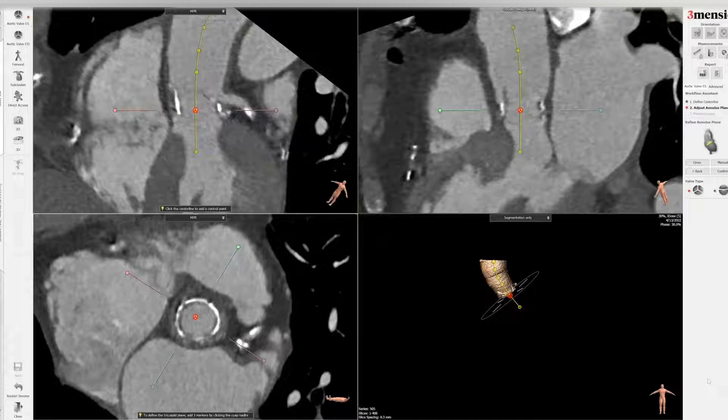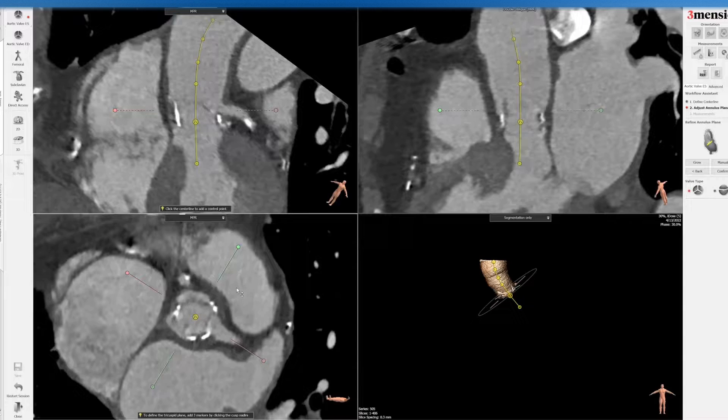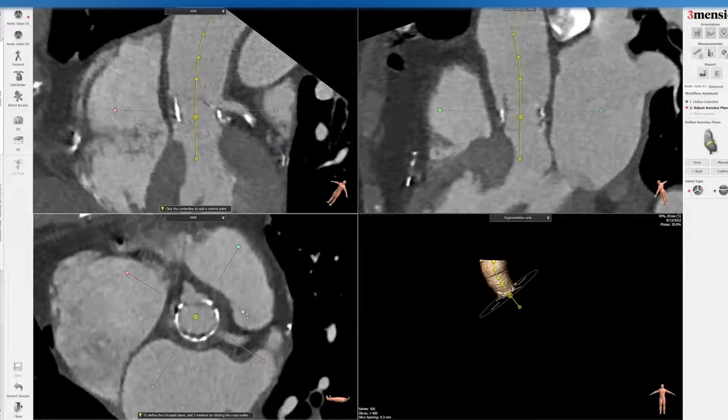Hello, today I'm going to show you the Valve-in-Valve TAVR workup with the Trifecta surgical valve. This is a 19 millimeter Trifecta valve — a very small valve — and you can see that signature here on the actual screen.